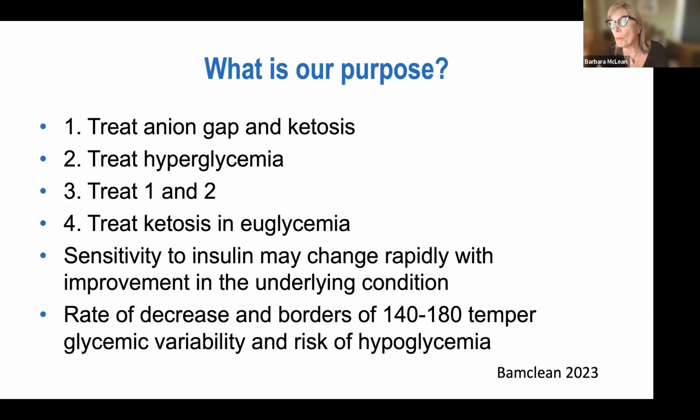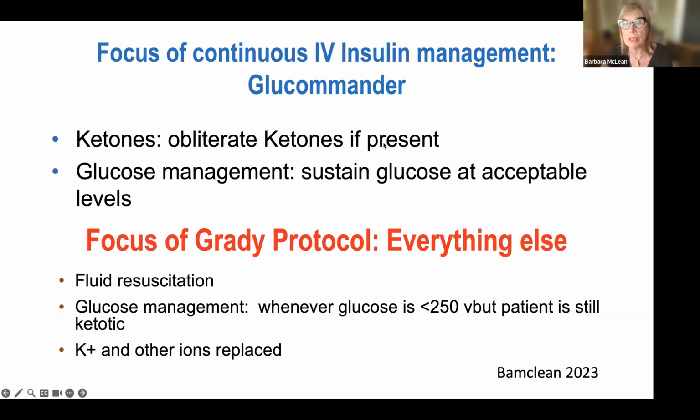The only time that won't be true will be if you are working with a laboring mother, at which point we will drop that target. That will be in a particular OB laboring mother order set. I don't think any of you will have that patient, hopefully not, therefore you will never use that. So the multiplier and the target are what really ensure a relatively safe drop in your patient's blood sugar and protecting them from hypoglycemia.